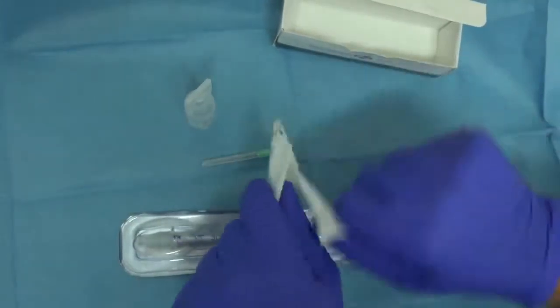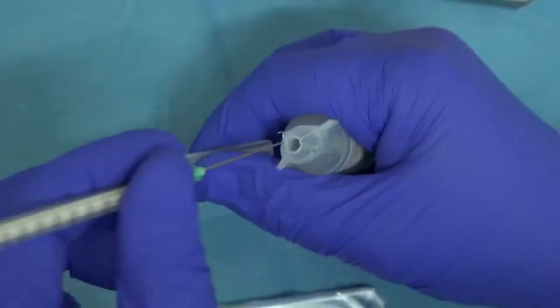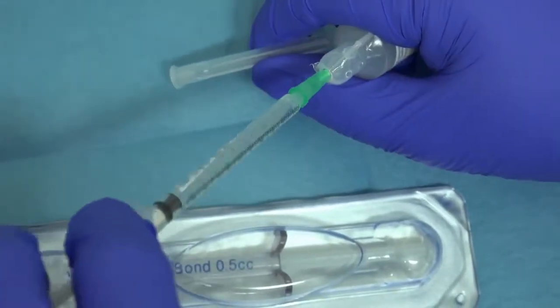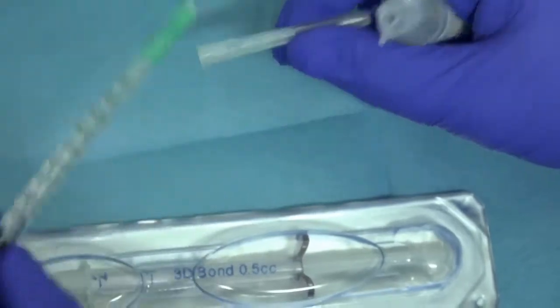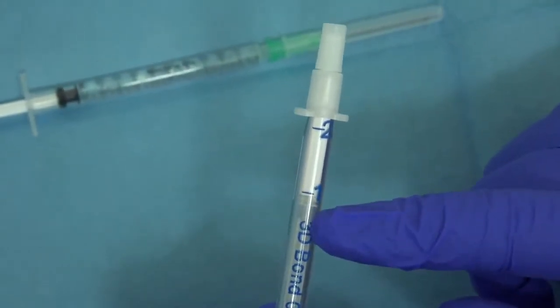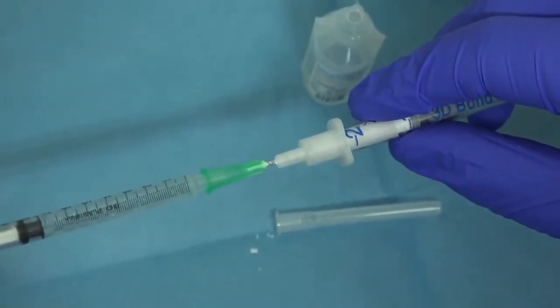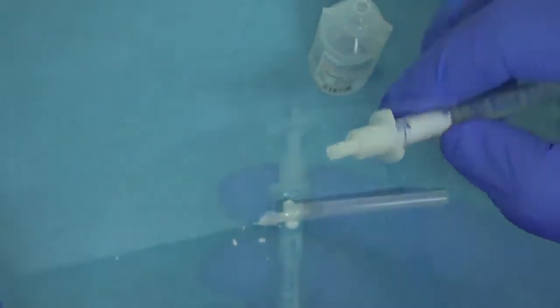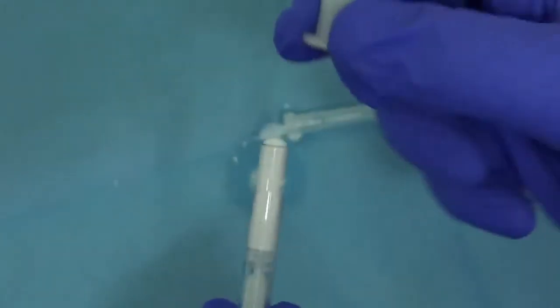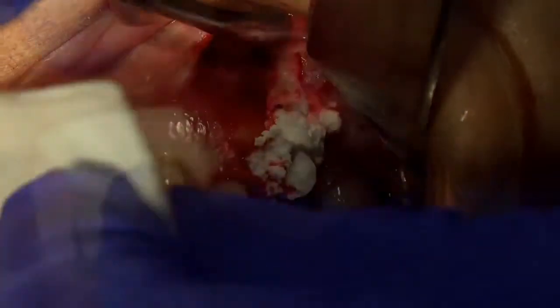Now we prepare the activation of the 3D Bond. We have in the application kit a syringe, a needle and a sterile saline, and we fill this syringe completely with saline. Now we take the 3D Bond from the blister, we push the piston until line number 1, remove the small cap, insert all the way down the needle and withdraw 1 mm back, then start ejecting the liquid until a small drop is coming out, then push the piston slowly in order to expel the liquid surplus until we have full resistance. Then we remove the cap and we eject it into the site.